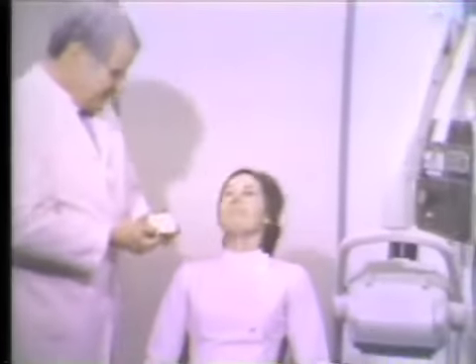Assuming, however, that the positioning of both patient and X-ray has been carefully done, the radiograph will give the dentist the desired view, and the patient will benefit from the information derived from it.